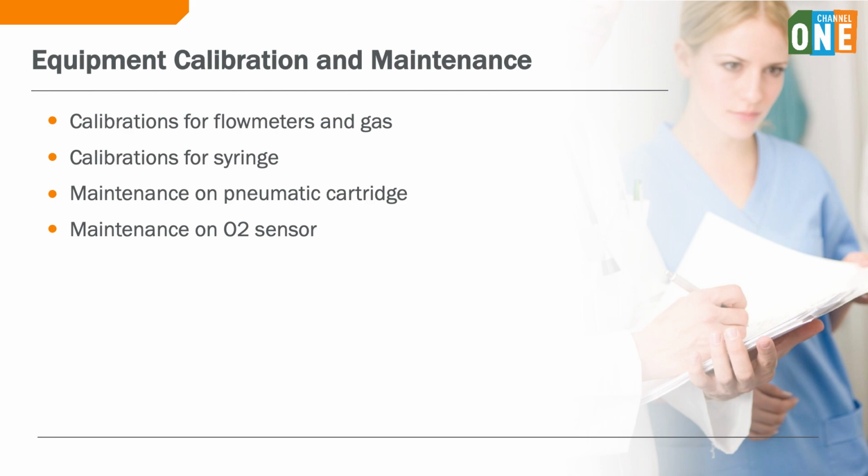By optimizing patient selection, test performance conditions, and equipment maintenance, indirect calorimetry becomes a highly reliable tool for delivering precise, individualized nutrition through the continuum of critical illness.